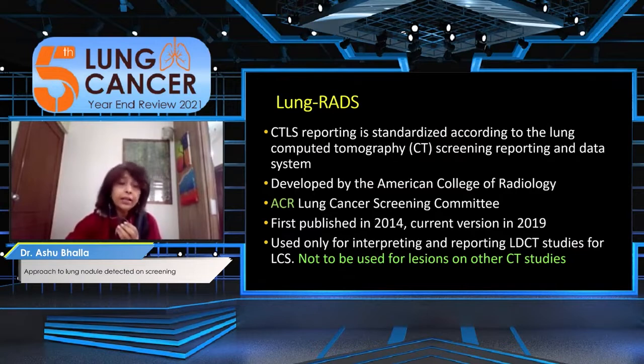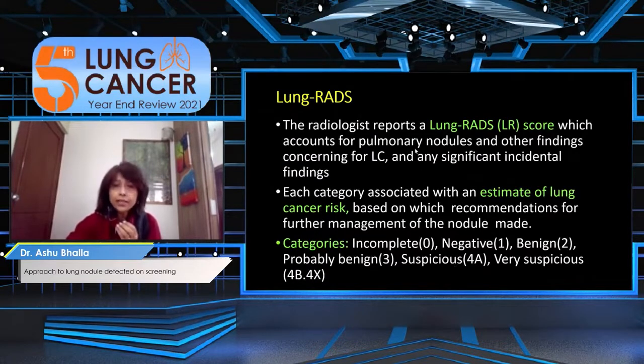Having said that, it does contribute a lot to our understanding of pulmonary nodules and their likelihood of being malignant. So it is not to be used for lesions detected on any other CT studies. At the end of assessing the CT, we give a Lung-RADS score. You label it as a positive screen or a negative screen and then suggest a further action.